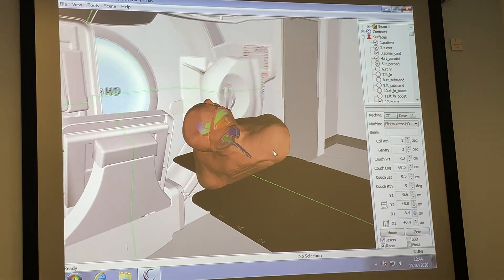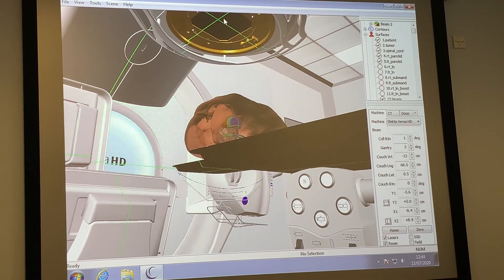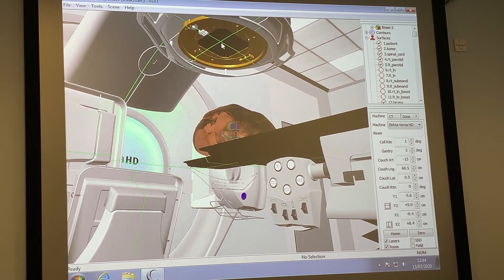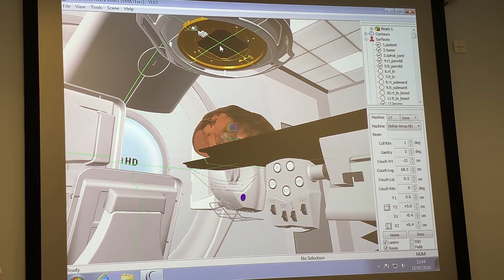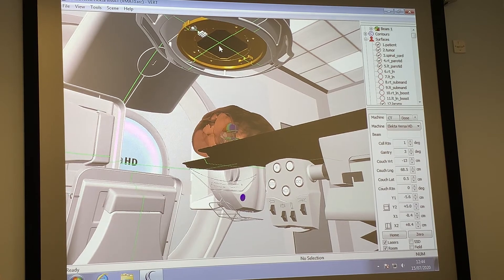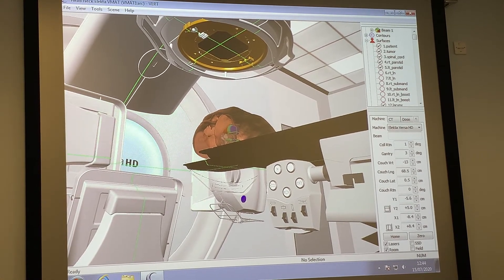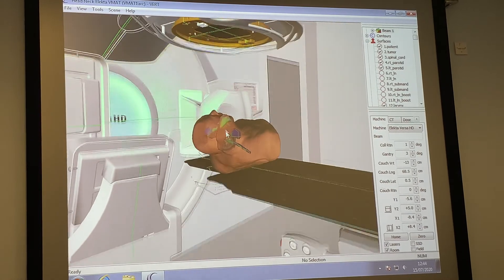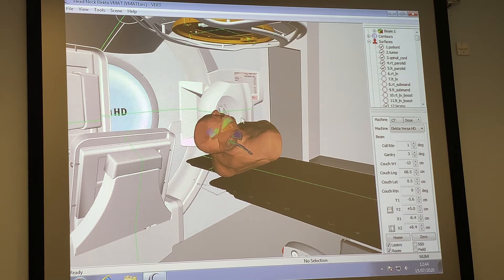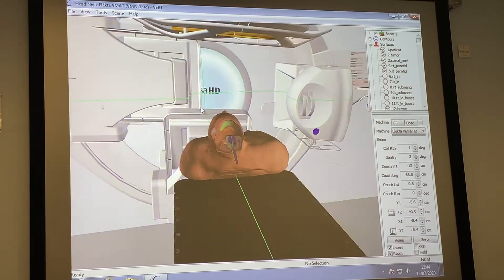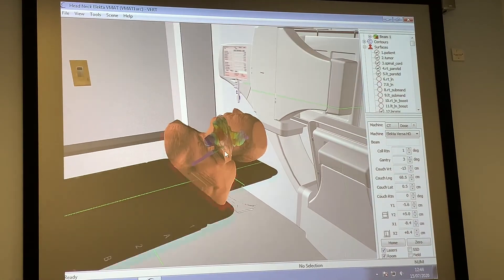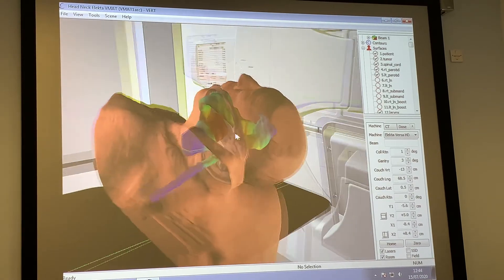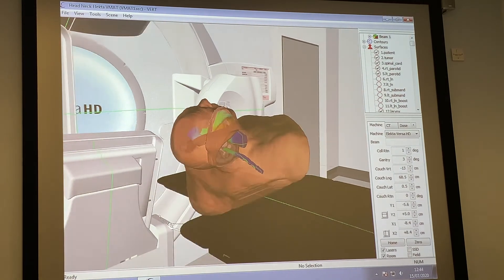In terms of the treatment itself, it is directed from the head of the radiotherapy machine. We have different types of treatment we can deliver, with the newest innovation being volumetric arc therapy, where the machine actually moves around the patient continuously and modulates the intensity of the radiation dose to different parts of the patient. That obviously allows us to achieve the dose parameters I've just described around the organs at risk and the tumour volume. We'll show you what it looks like in real time now.